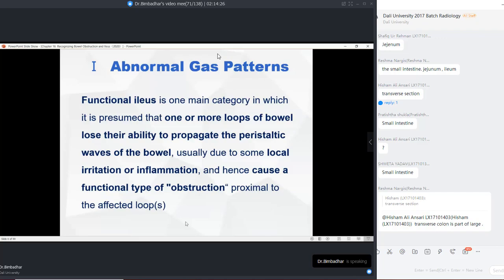It is obviously saying that it is obstruction, right? And a dilated loop along the right hypochondriac region is telling you that there is a functional type of obstruction, which is a functional ileus, right? But what exactly is the clinical condition that is causing this kind of functional ileus? So obstruction is a result of this problem, but what is the real problem that is causing it? That is based upon history. You tell me, how are you going to proceed with this patient? What are you going to look for? What are you suspecting? What is your provisional diagnosis when I gave you symptoms like that?